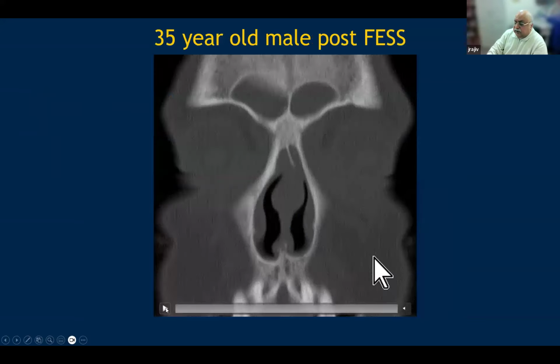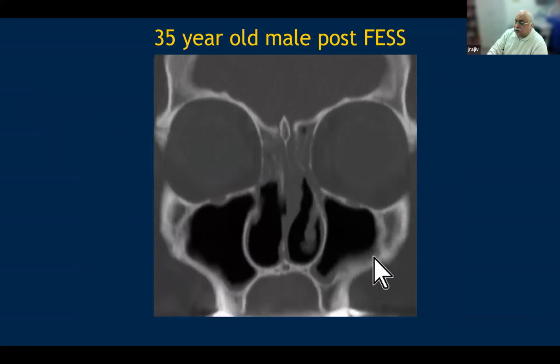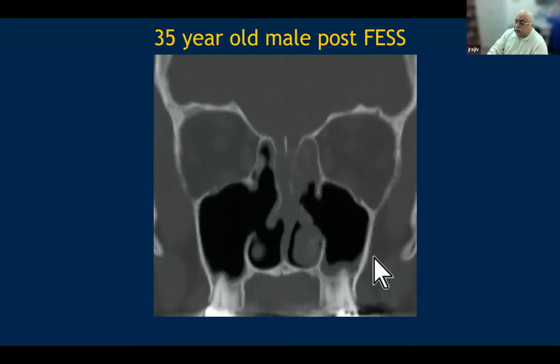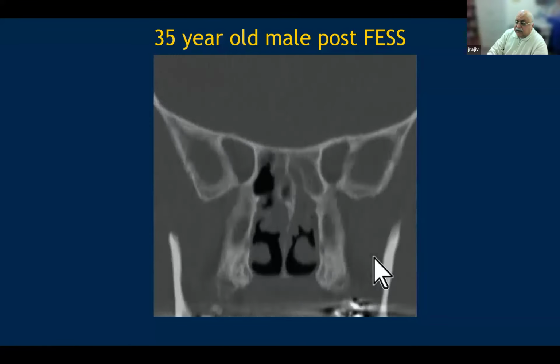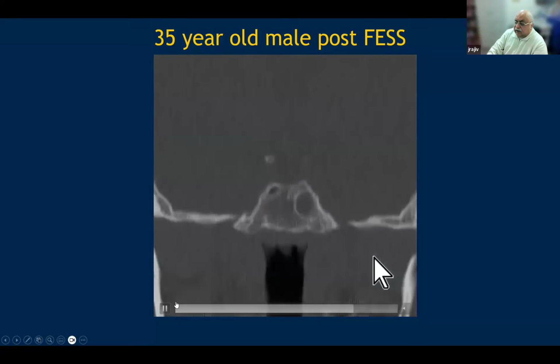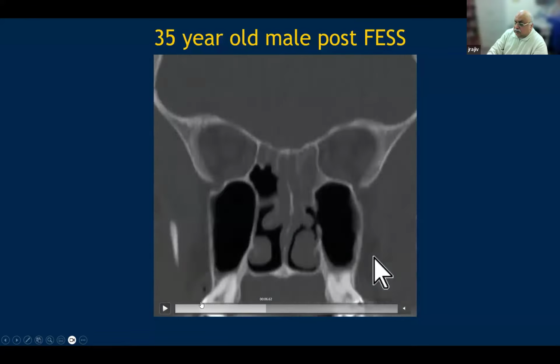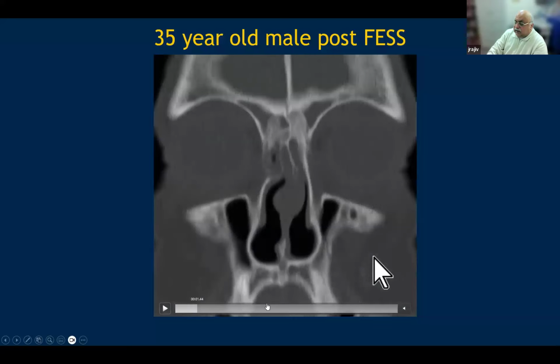So here's an example, a quick look at the same patient we saw earlier on, where we left the structures which we saw in the initial slide. For the sake of time, let me go to the next slide, which will be important.